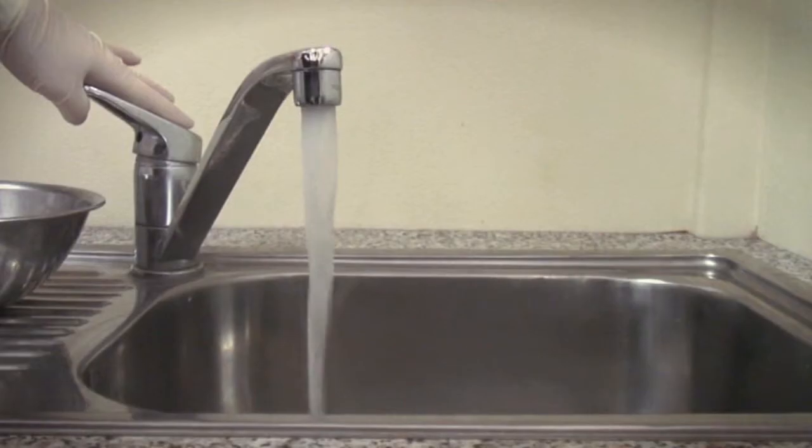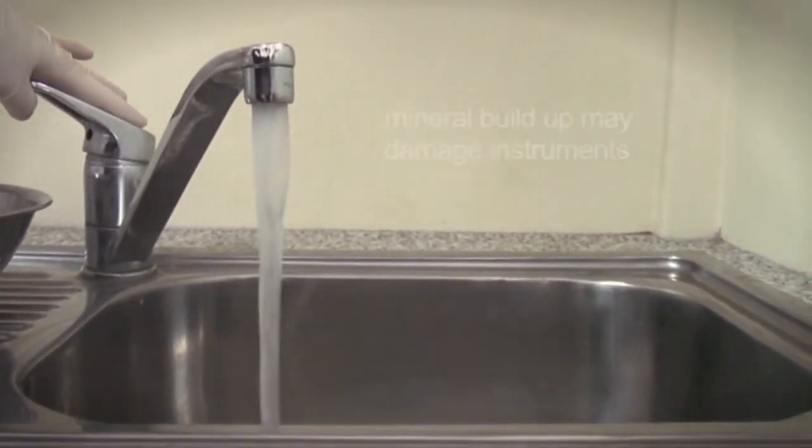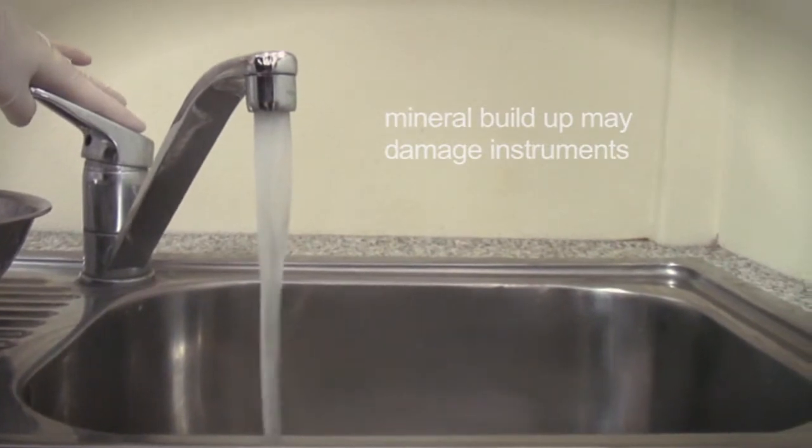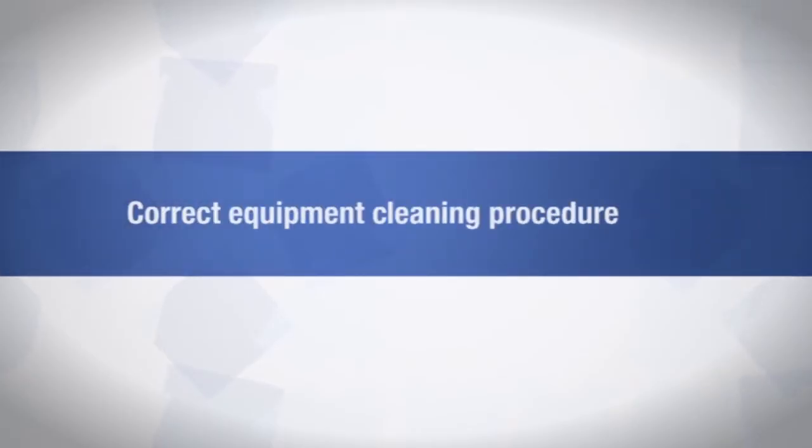Always use good quality water for cleaning. Water with a high mineral content is not suitable for rinsing, as the mineral deposits can damage your instruments. Make sure to follow the manufacturer's instructions when using cleaning products on instruments. So now let's step through the proper processes for equipment cleaning.